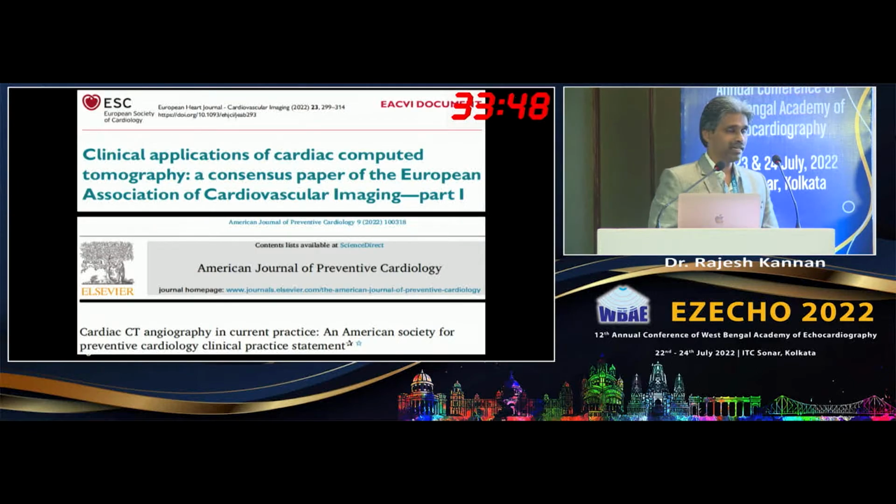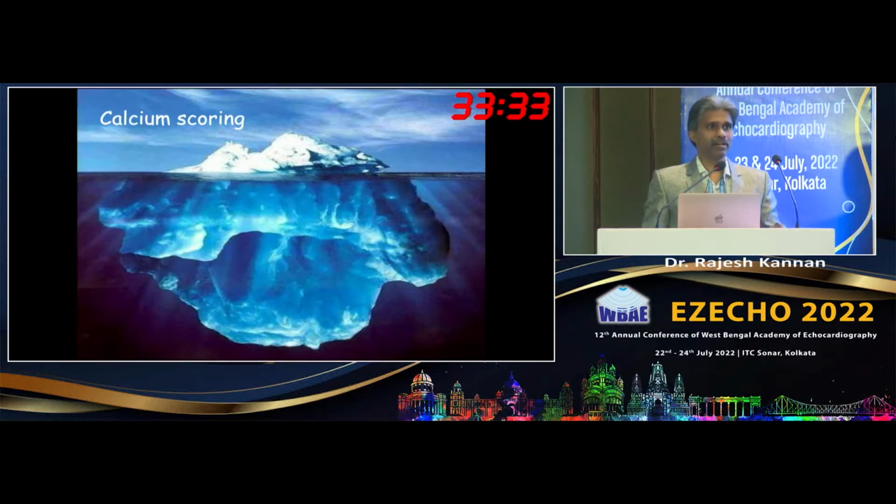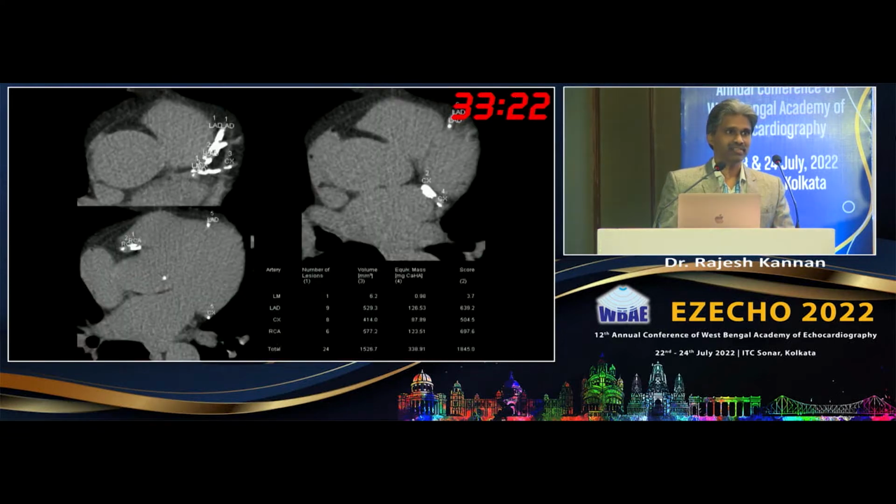Many of the guidelines now show the importance of cardiac CT in the evaluation of patients with chest pain. We'll look at the different indications and types of cardiac CT. The first is calcium scoring, which is a plain scan and a very well established method in risk assessment.